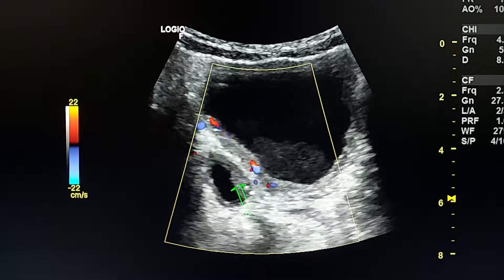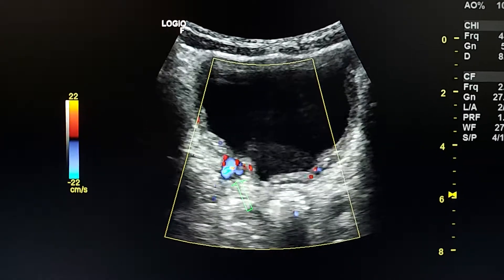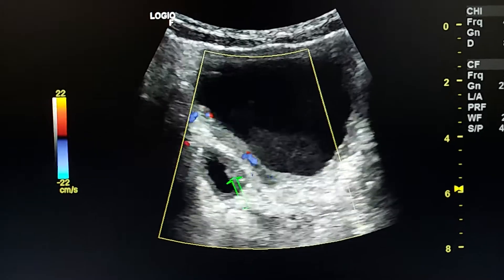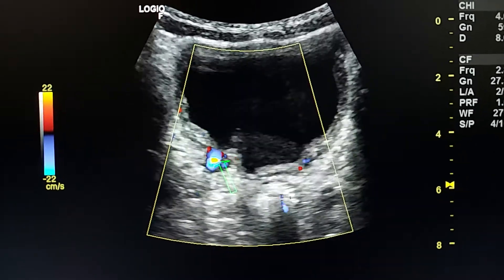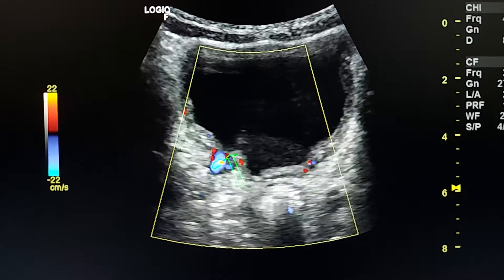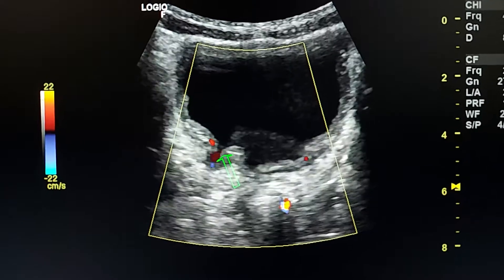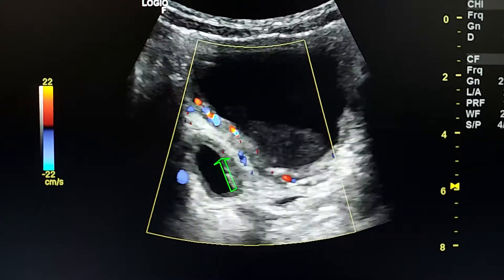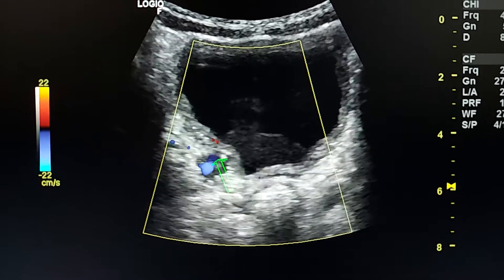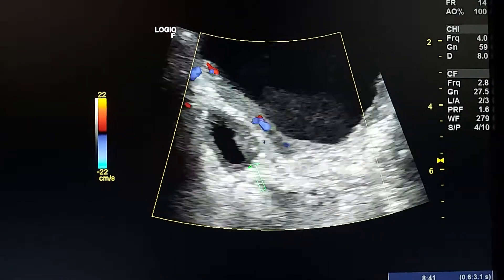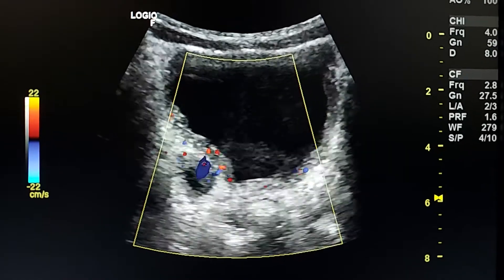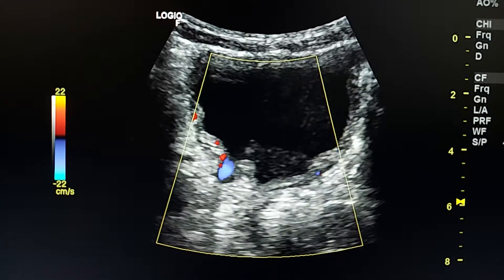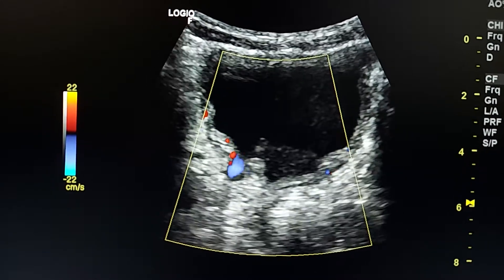By color Doppler and compression on the urinary bladder, we see flow in and out from the diverticulum. The flow towards the diverticulum is shown in red, and the flow out of it is shown in blue. This confirms that this cystic lesion is a diverticulum with a narrow neck.